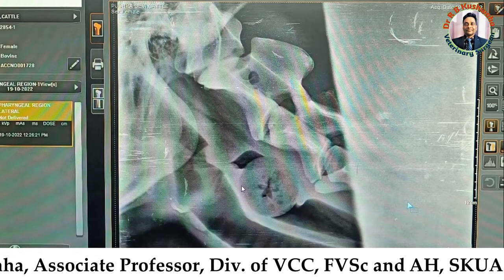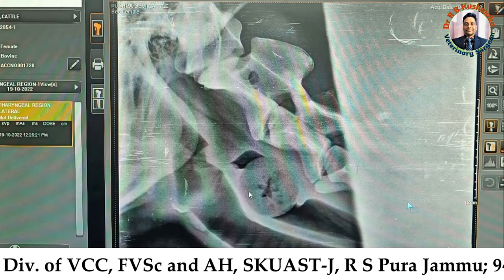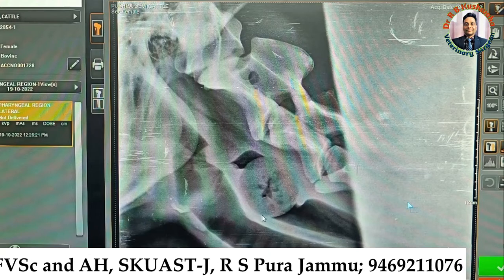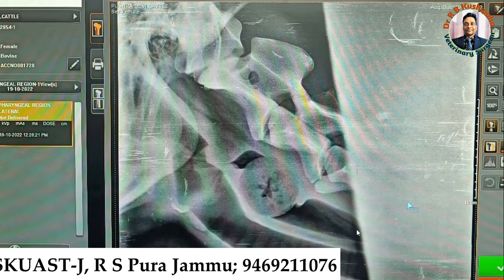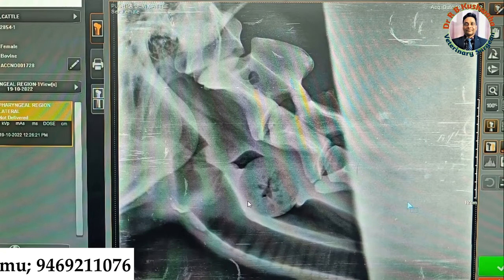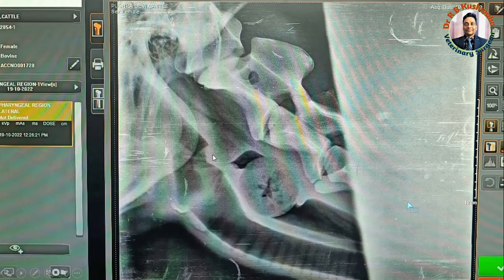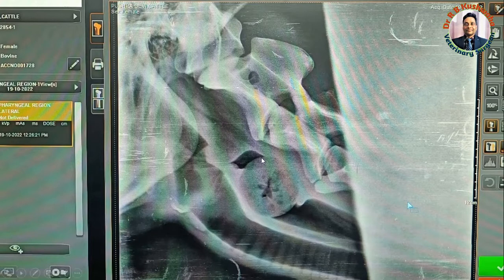This is the oropharynx — the pharyngeal region. You can see this apple is obstructed and lodged in the pharyngeal region. Because of its circumscribed or circular shape, it is not able to pass distally. Such obstruction normally leads to severe tympani. When we asked about the history, the owner told that immediately after the animal took the apple, there was tympani, salivation, and regurgitation of water from the nostril, and the animal stopped taking anything.